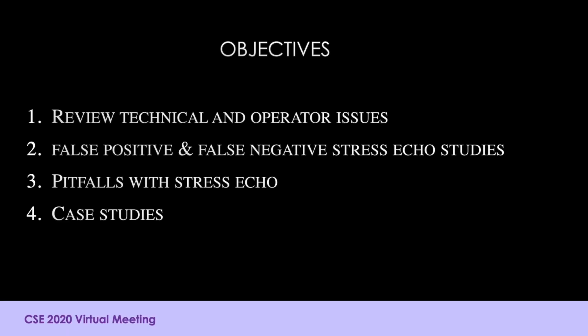The objectives of this talk are to review the technical and operator issues, to review false positive and false negative stress echo studies, pitfalls with stress echo, and to follow the last part of the talk with case studies.